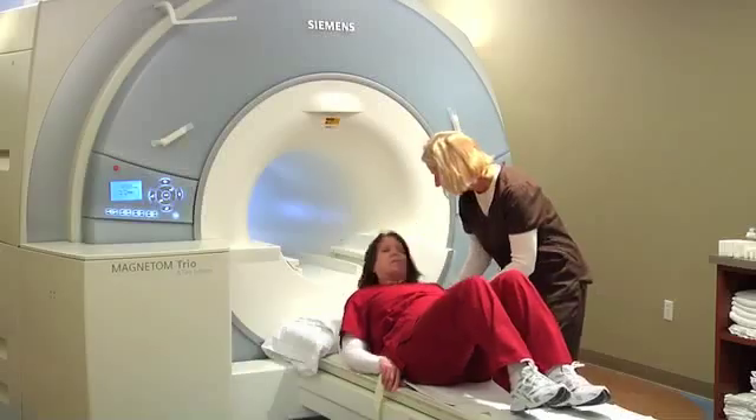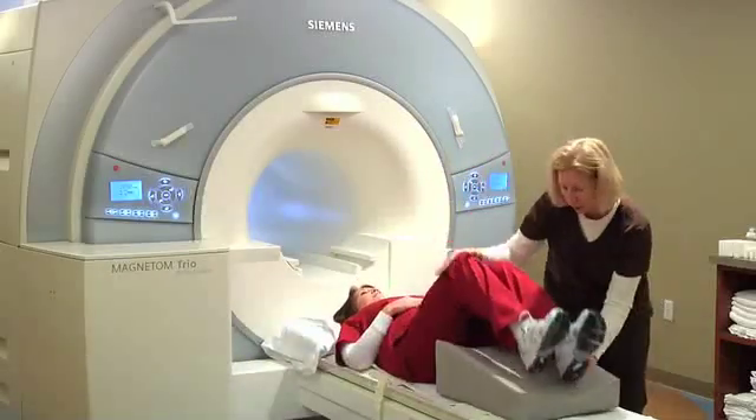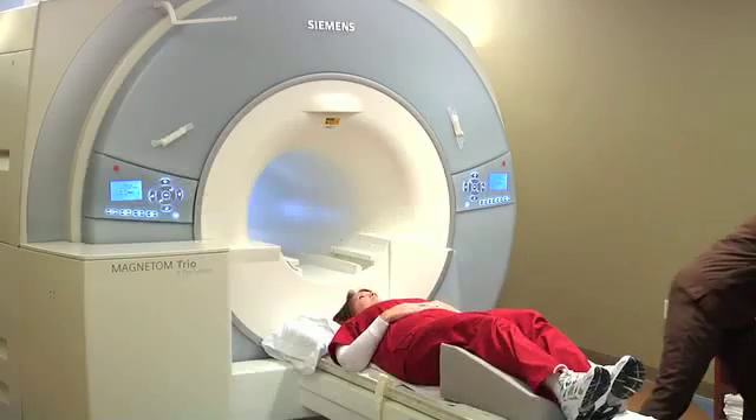Once inside the MRI suite, you're going to be asked to lay on your back with your head towards the MRI scanner. A cushion will be given for your knees to take some pressure off your back.